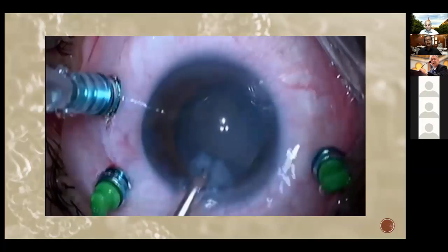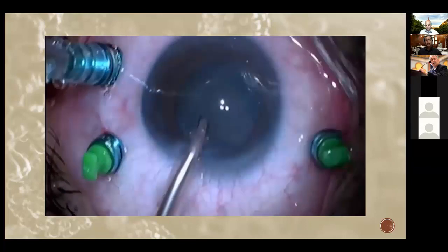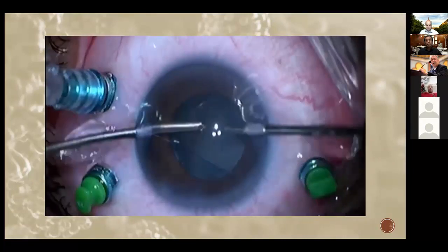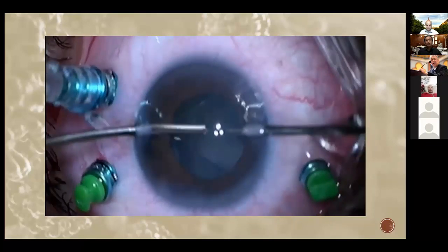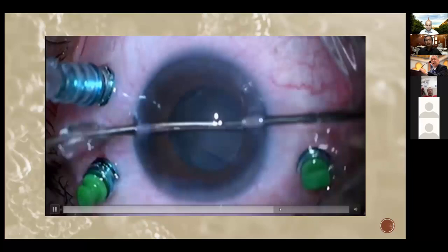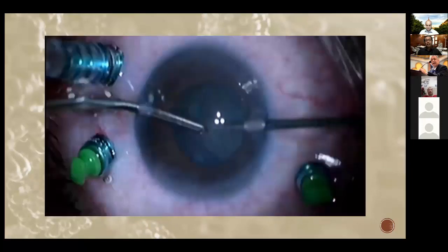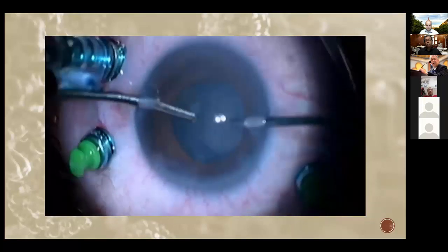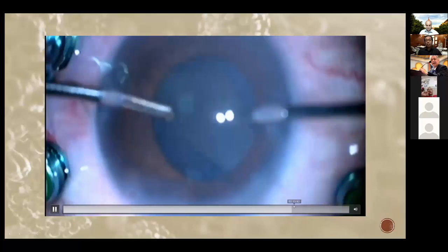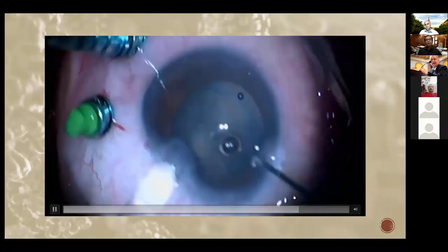And had this been properly managed from the beginning, if I managed to equalize the pressure between the intracapsular and the anterior chamber, things would have looked different. We're going to go with simple polishing to the anterior and posterior capsule so we can enhance the visualization during the vitrectomy. And as you can see, magnification, as always, Dr. Yahya would always say, magnification is the key to a successful surgery.